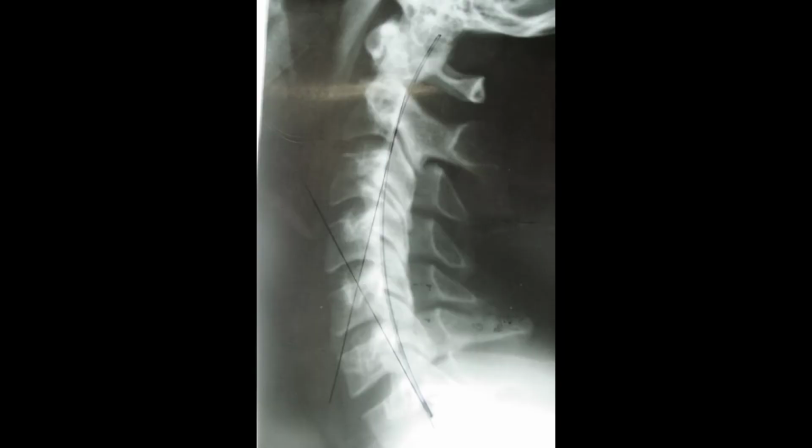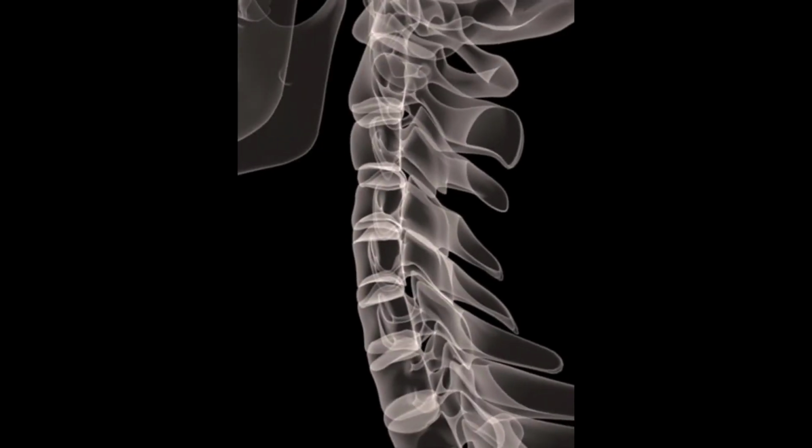This x-ray is a side view of a normal neck. This is the jaw and this is the back of the head. In a normal healthy neck, you should have a good curvature like this. Notice how all of these vertebrae follow this curved line here. Gravity is always pushing down on your head, and when you have a good curvature in your neck, all the weight comes down and rests on these joints right here called the facet joints, and they carry the weight of your head like a spring with no problem.